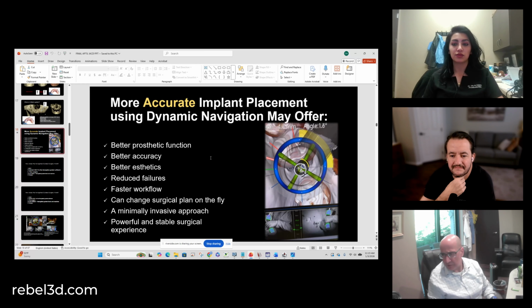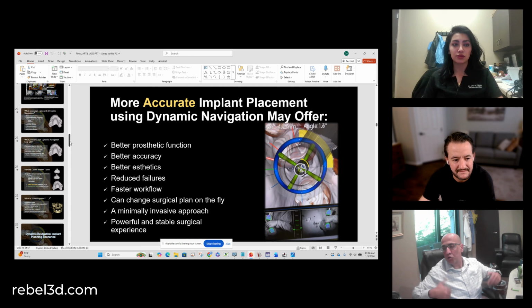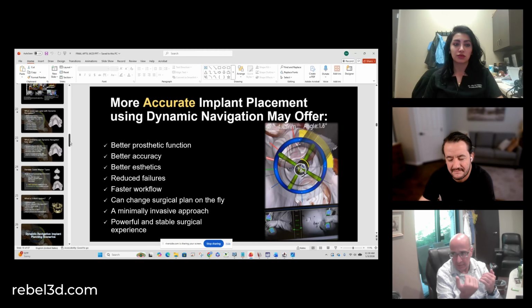So now she gave me the final result and asked me to do my surgical planning to serve her design. Sometimes, you know what? Oh, no, it doesn't work this way. We need to do something differently. So we start to do some negotiation before I start my surgery, to get this end result that the patient likes and wants before we start my surgical planning.